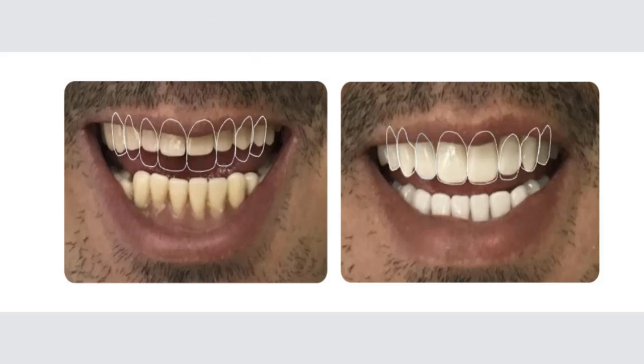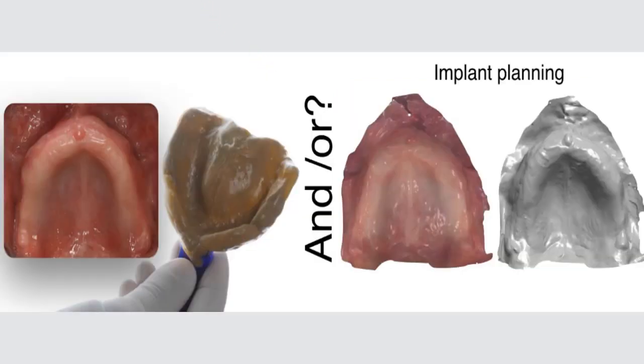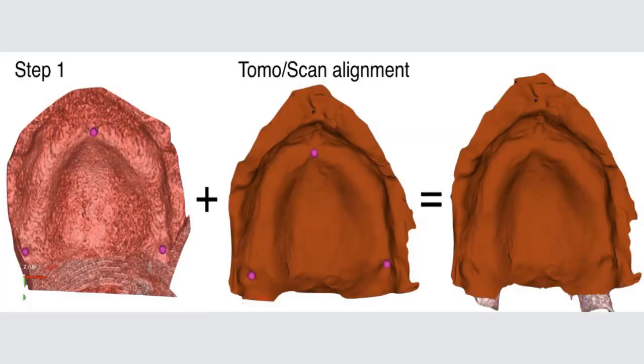But what is important here is that when you have an edentulous patient for placing implants, we first do a nice and decent complete denture. That's what I do. I don't go and place implants and start from there. It depends on the philosophy of work. I'm not here to discuss that. Do a nice complete denture, and I did that using the digital environment. Printing is taking over. We have now more printed restorations coming along. But anyways, this is what I have done.